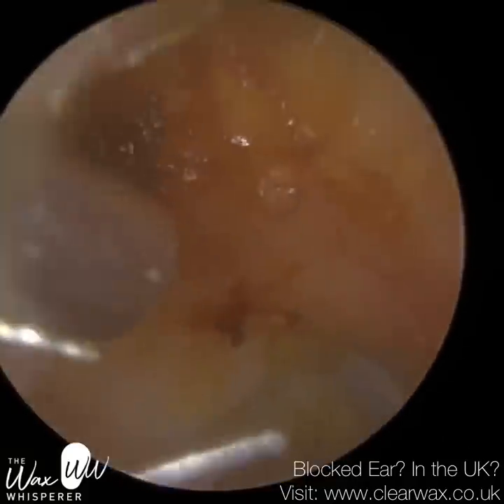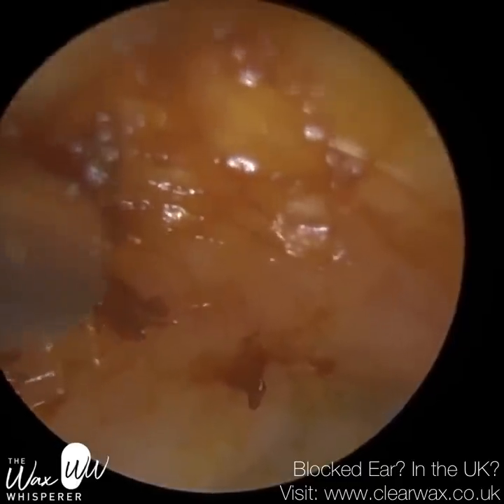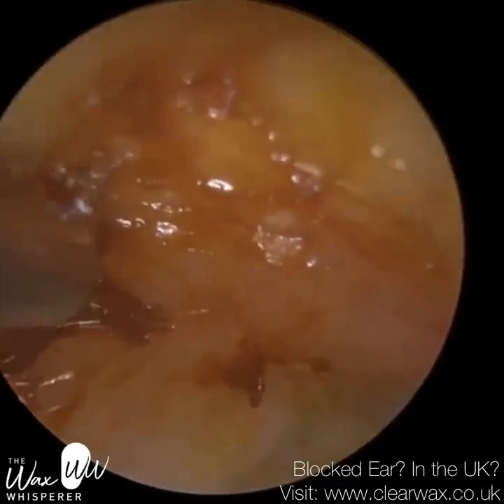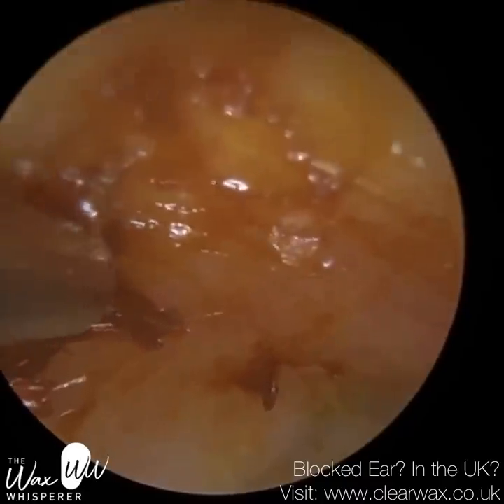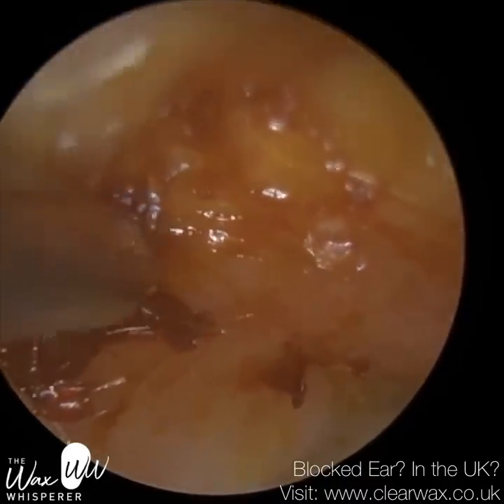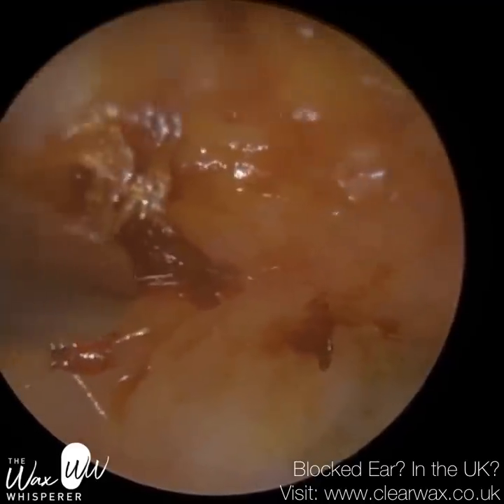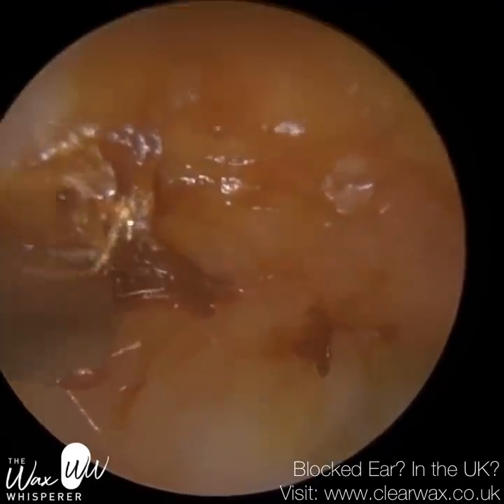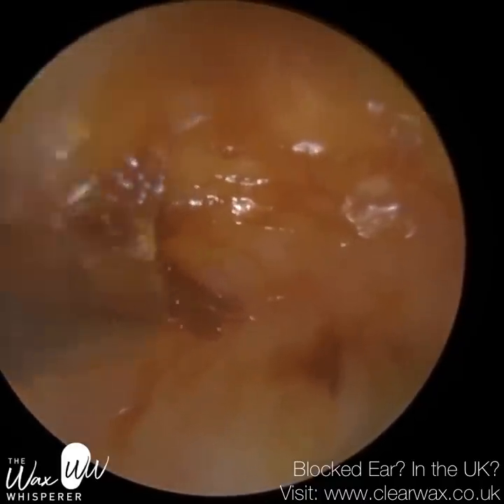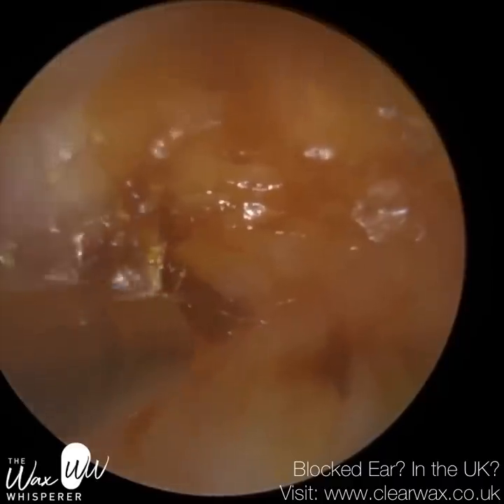So I'm just going to go back into the ear — just some residual wax and skin around the edge. It was impacted and sticky, so I don't think this really comes away, but I'm just hovering over. Because we're on the bony part of the ear, we've got to be careful. We don't want to cause any trauma because the bony part is a very sensitive part of the ear. On the screen it looks big, but it's natural wax — we all have a bit of wax. It's just coating the surface, so it's nothing to be concerned by.